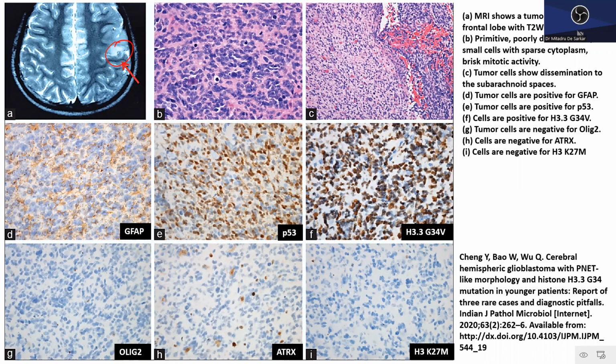So let's see this particular case where you had a small glioma within this cerebral hemisphere, and morphologically speaking it gives you the kind of small round cell morphology. And once you analyze the tumor in a sequence, you see that some important findings come out, right? First of all, the expression of GFAP is patchy, focal. There is a complete absence of OLIG2, which is basically a glial marker. So this OLIG2 is not expressed. P53 is upregulated in the tumor cell nuclei, and ATRX expression is lost. So that's an important thing that I said can be seen in this particular family of tumors.